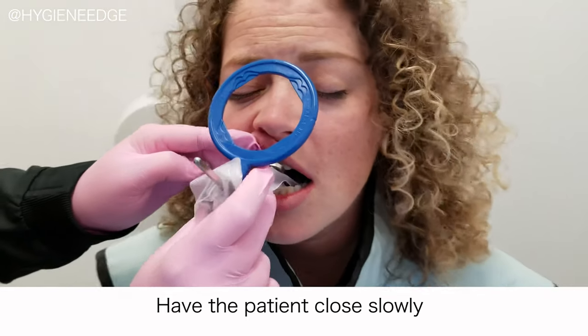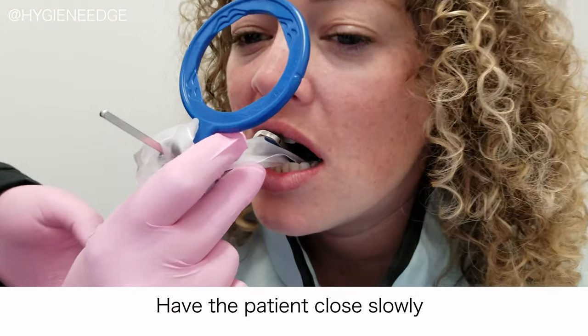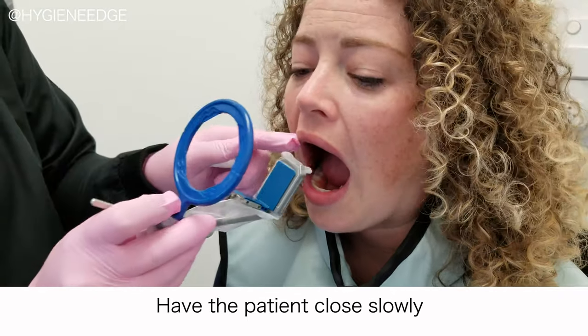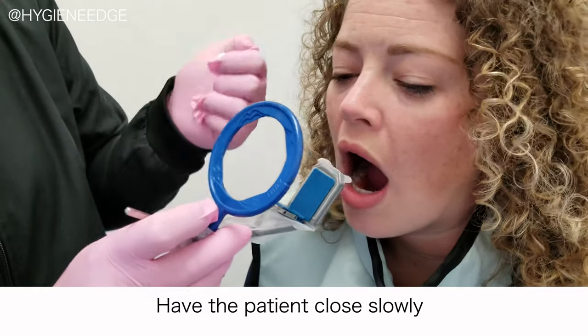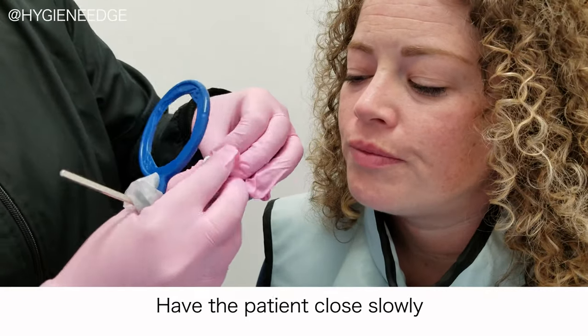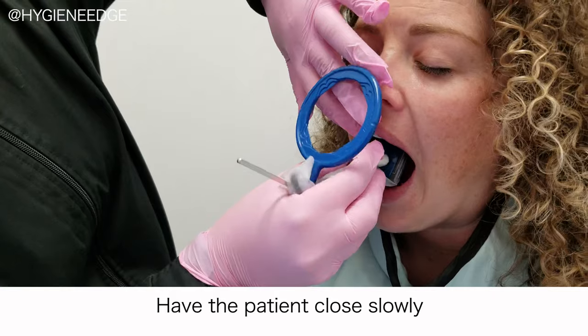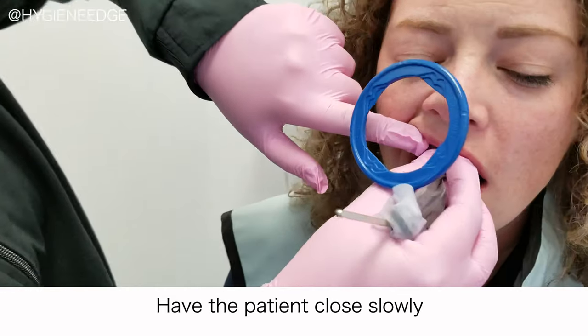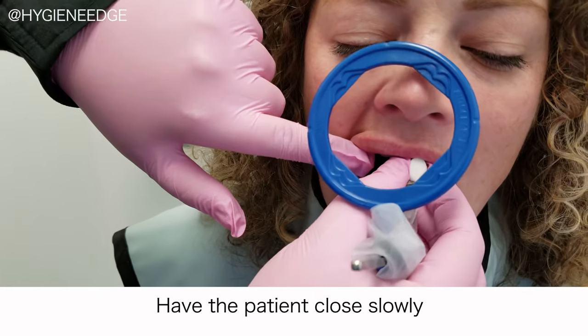Number three, always tell your patient to bite slowly or close slowly. I always say 'bite' so they can use their teeth — sometimes when we say 'close,' they close their lips and not their teeth, but both work. I always say bite nice and slow, so I can place it exactly where I want it, and if it feels like it's getting out of the way, I can redirect it before they close all the way.